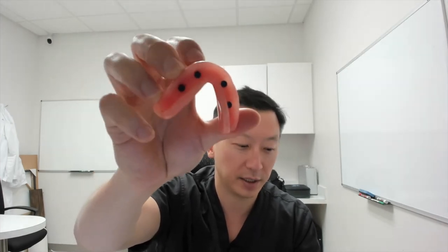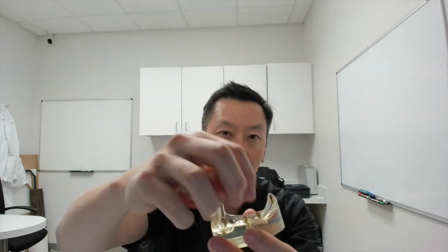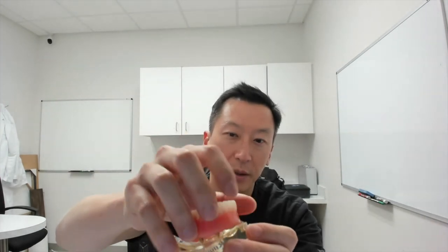When you get a snap-on denture, the part that actually needs maintenance is on the underside. It's what they call the male part of the snap-on denture. Actually, I would call it the female part, but for whatever reason they call it the male part. The little blue things you see here are made of nylon, and they're inserts that fit the parts that come out of the implant. These project out of your gums and snap in on the underside of your snap-on denture. You heard that little click, that's how your denture stays in place.